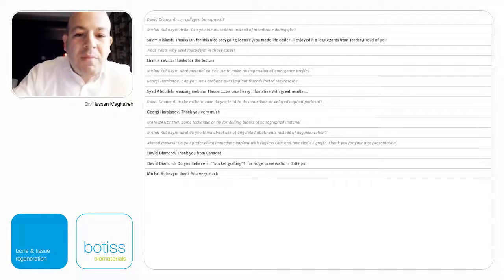Michael again. What material do you use to make an impression? Oh, this is a good question. Obviously, it's a completely different topic, but I like to do flowable composite. Just dry your impression post, dry inside and flowable composite. You could either do direct customization or indirect customization. I'll be more than happy to discuss this in the future.